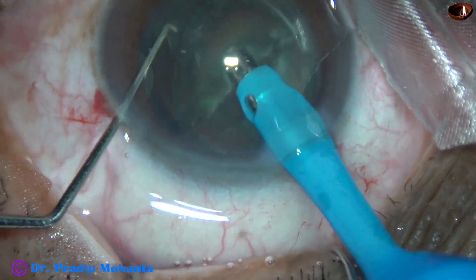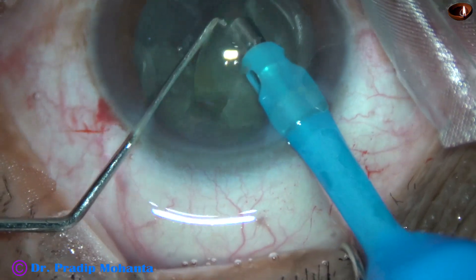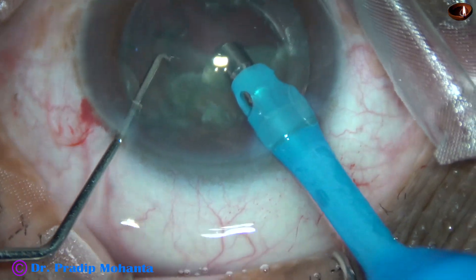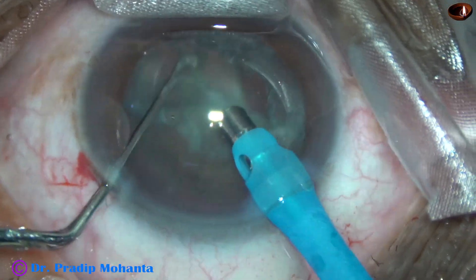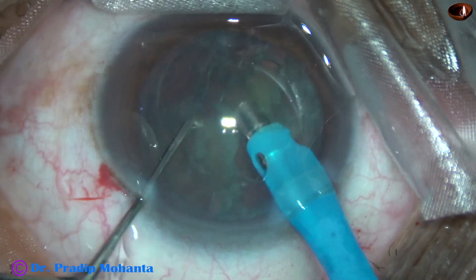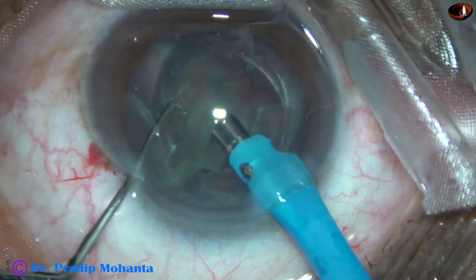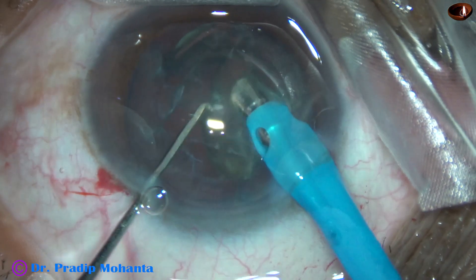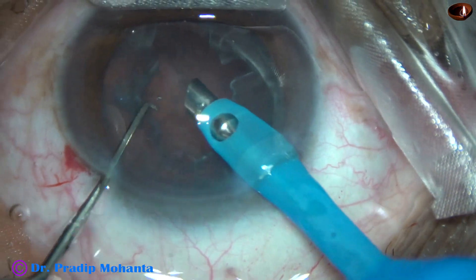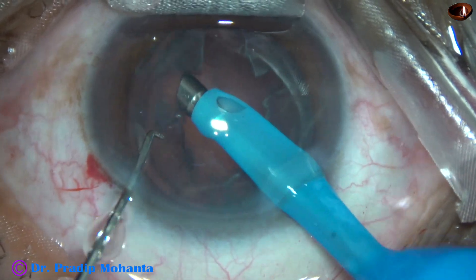Now each heminucleus is again held beveled down, and the free nuclear fragments are emulsified when the tip of the feco needle is beveled down. With the other heminucleus, it is a little faster when the tip of the feco needle faces towards the posterior capsule. The followability is more, and the pieces come to the tip very easily.